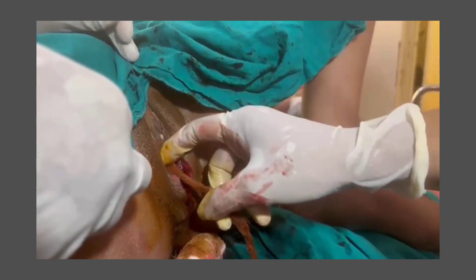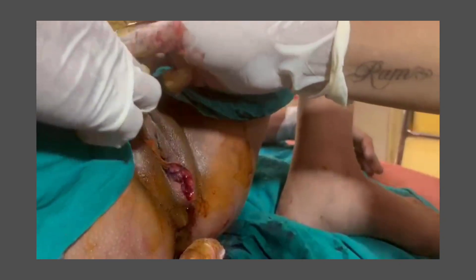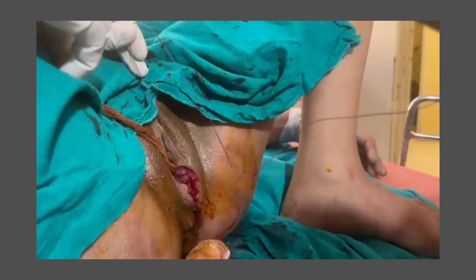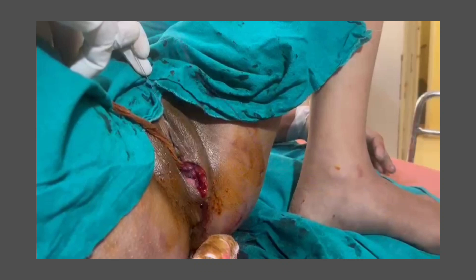A sausage-type pack is kept in the vagina. The tag always has to be left out, and never forget to remove it — otherwise it will be like a foreign body, and it's not good to leave anything inside.